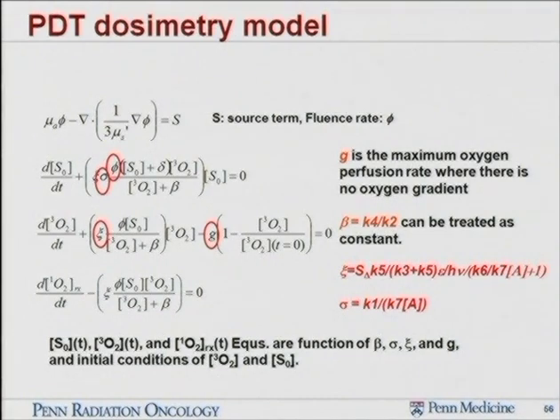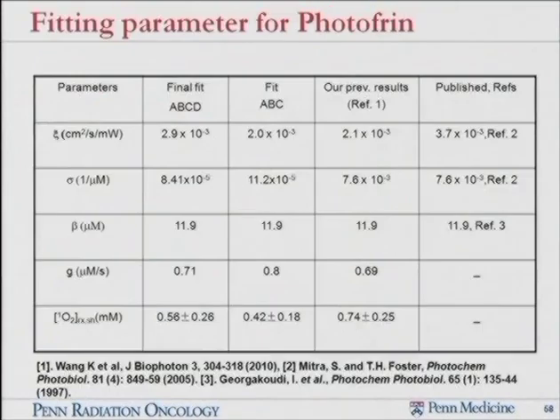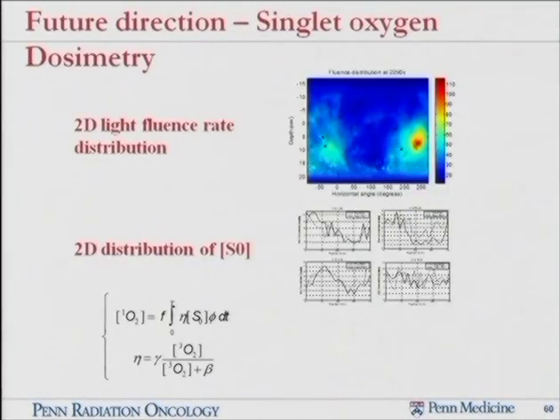We are using the unit as concentration, so one kind of sees that as instantaneous concentration, but it's actually the accumulation over treatment time that we are quantifying. So this so-called reactive singlet oxygen really is not instantaneous oxygenation at any single moment. As a result, the quantity we're getting really is the integration over time.